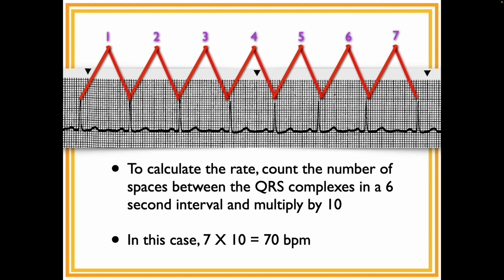Now, I can take into account the fact that this one starts just a tad before the mark, but handily, this one just happens, coincidentally, to end a tad before this mark. So in my mind, I'm kind of shifting it over and saying, that's pretty close to exactly 6 seconds between this one and this one.